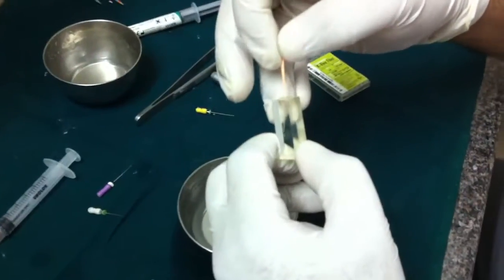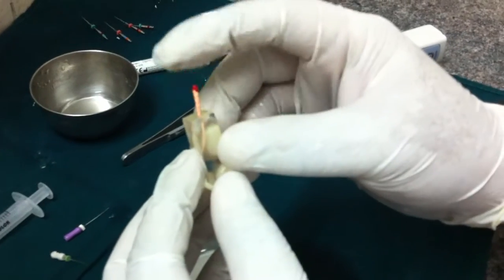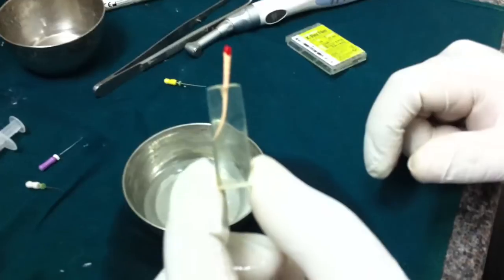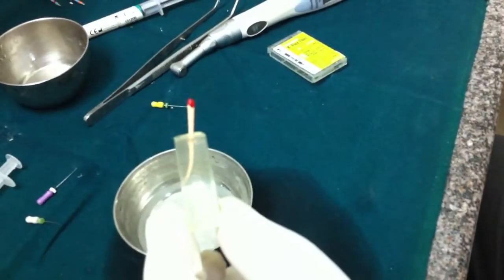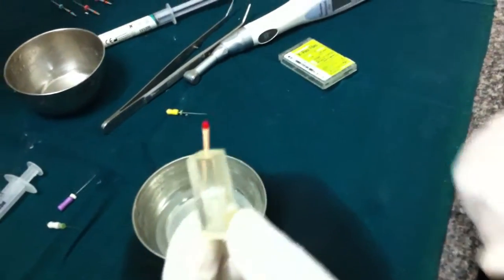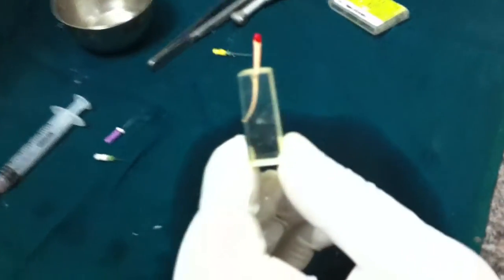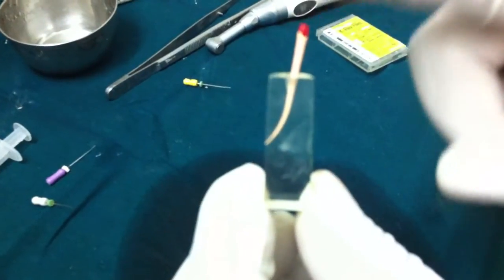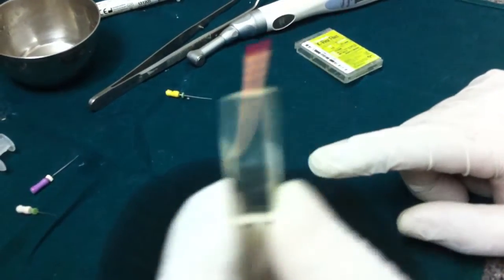Now see here, I am introducing the 25 6%, and the 25 6% has a perfect snug fit.